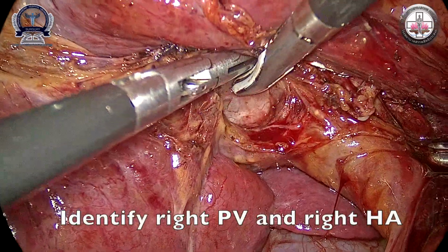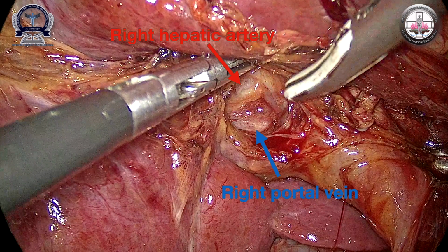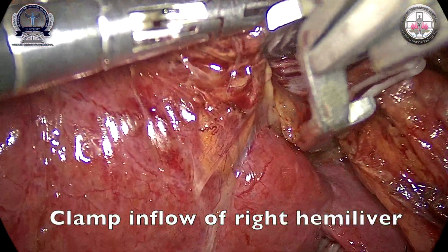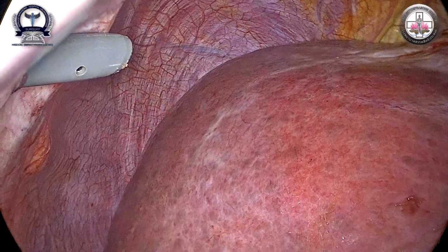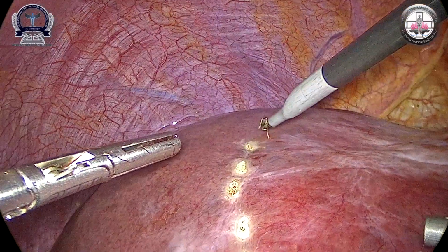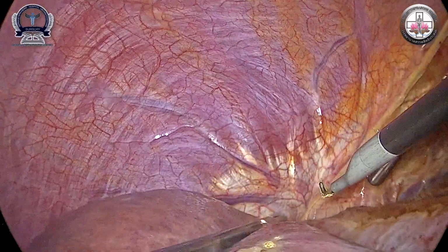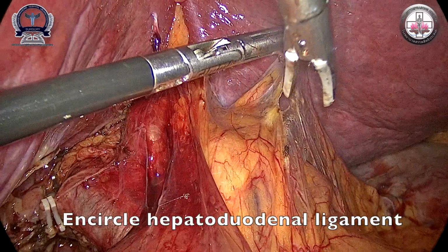Dissection to identify right hepatic artery and right portal vein was performed. Inflow control of right lobe liver was done to identify a demarcation line. Preparing to perform the Pringle maneuver was done by encircling the hepatoduodenal ligament.